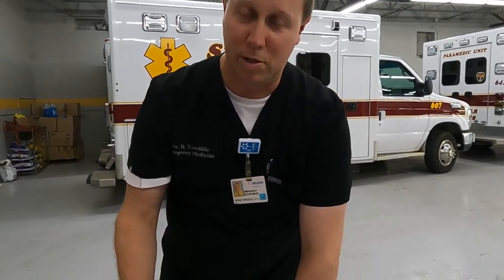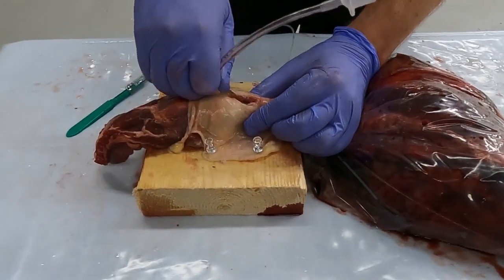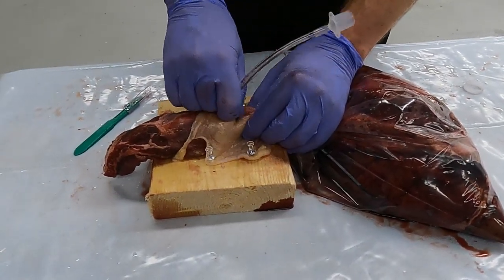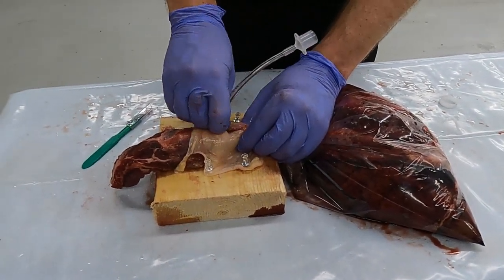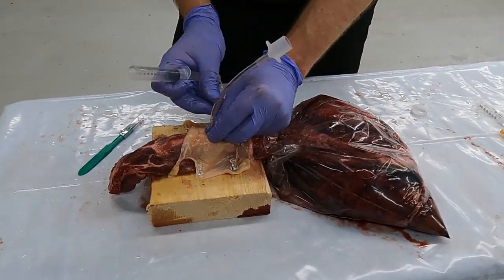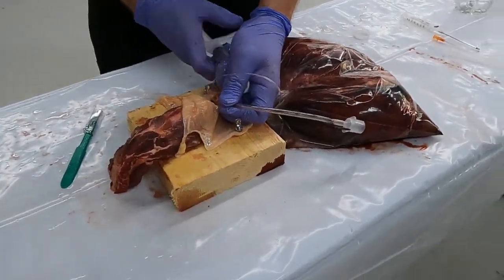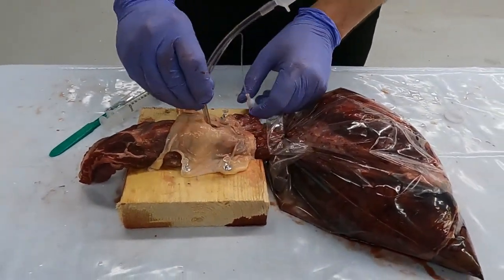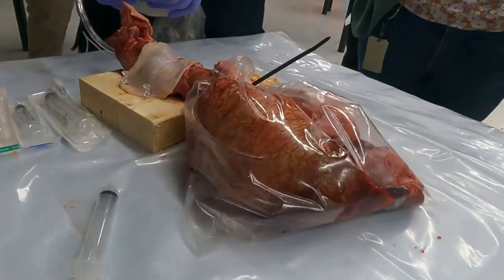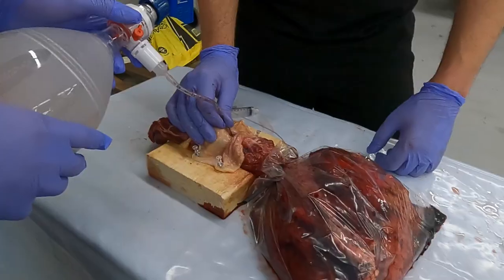Then take your ET tube, place it into the hole you just dilated, and push it in until the balloon disappears — we're not concerned about being too high here, we're concerned about being too low and ending up with a right mainstem intubation. Inflate your cuff, and as long as you can't see your balloon popping out of the hole, keep your hand stabilized and have your partner bag. That concludes our surgical crike procedure. The ingredients needed: a pig pluck, a chicken thigh, a block of wood with pins, and the rest of the sharps you should have laying around. I hope you found this worthwhile — if you want to do another one, you know how to contact me.